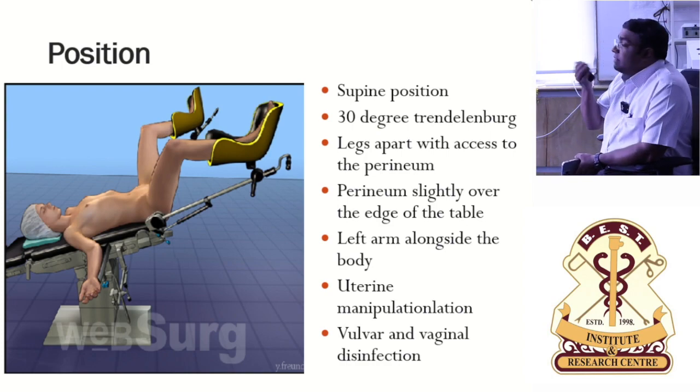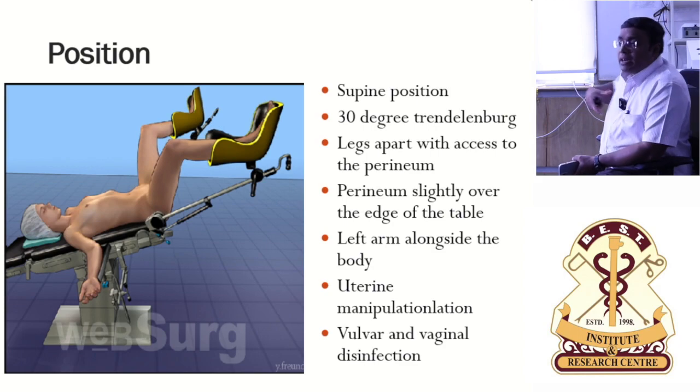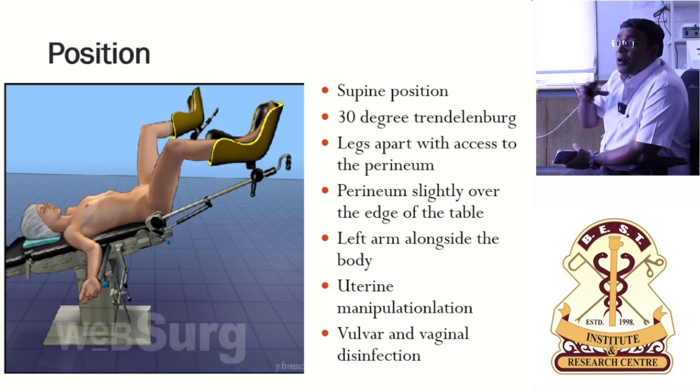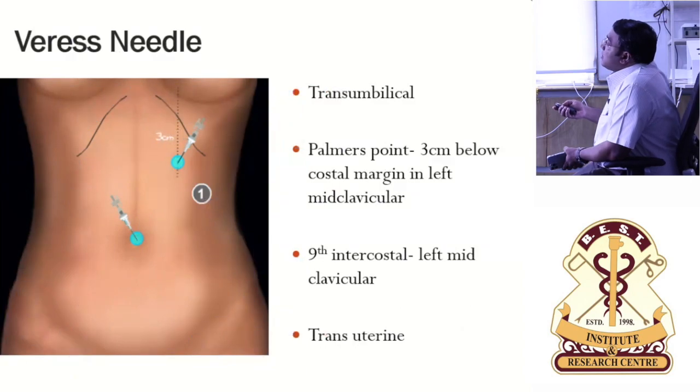Shoulder stirrups generally we don't require unless the patient is extremely heavy. If the patient is very heavy, then you can use a shoulder support, or else a simple strapping at the level of the chest, at the level of the nipples. You should make sure that the patient is strapped. You get a velcro strapping band, so that should be used, so that there is no single point of pressure, it should be uniformly distributed. Okay, these are the things.